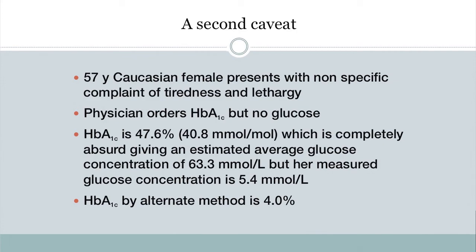Here's a second caveat: a 57-year-old Caucasian female presenting with non-specific complaints of tiredness and lethargy. The physician orders hemoglobin A1c following society guidelines, and we obtain a value of 47.6% — phenomenally high. That's completely absurd, as the estimated average glucose would be 63.3 mmol/L (well over 500 mg/dL). However, when we measured her glucose, it was only 5.4 mmol/L. We tested by an alternative method and got 4.0%, much more consistent with her glucose.